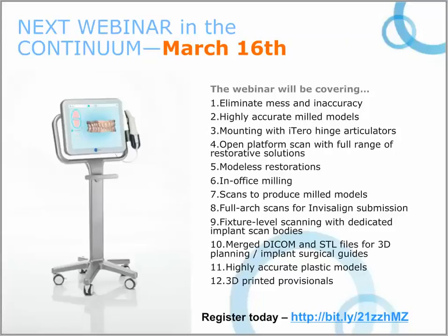Example, today I just had a patient. We did a 6-unit bridge on 4 implants. That restoration has been in the patient's mouth now for about 6 months, and we're going to put the final restoration in place on the original STL data that was derived when the implants were placed. In other words, the final restoration is going to seat on the original STL file for the predicted position created from the surgical guide. That's amazing stuff. And we'll look at some cases like that next week. So I think you'll find that pretty exciting.